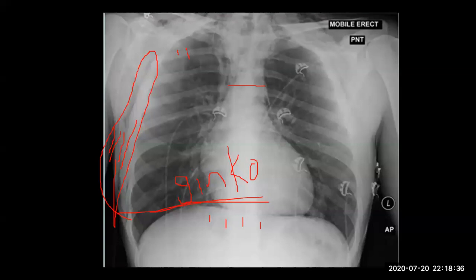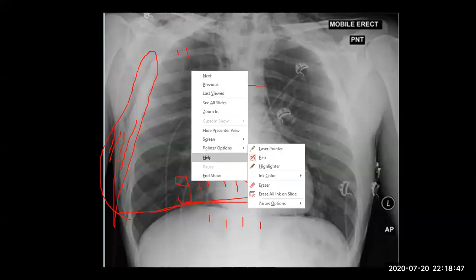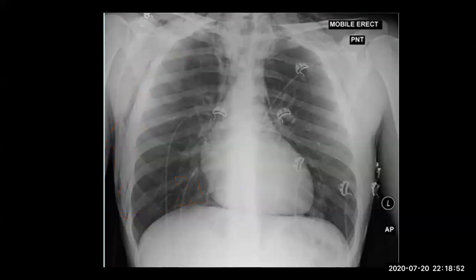and pneumothorax. How do we differentiate pneumomediastinum from pneumopericardium? By changing the position of the patient, lateral. Other than this, how can we do it? Changing the position is critical, sometimes you cannot move the patient. Extending lucency above the aortic knuckle means it is pneumomediastinum, not pneumopericardium.